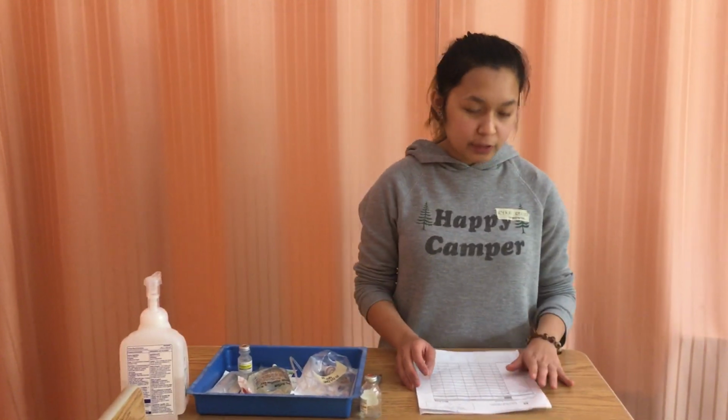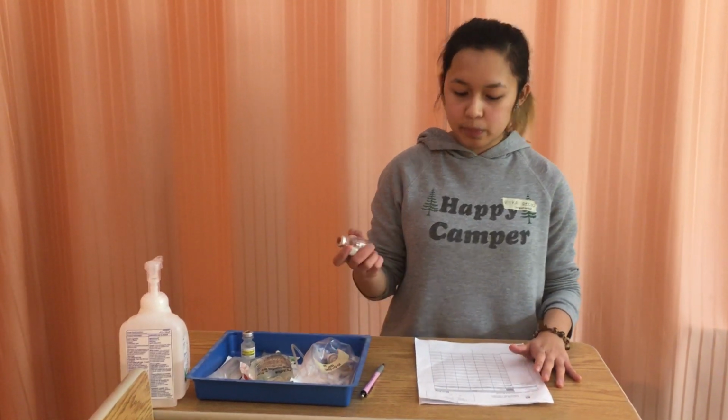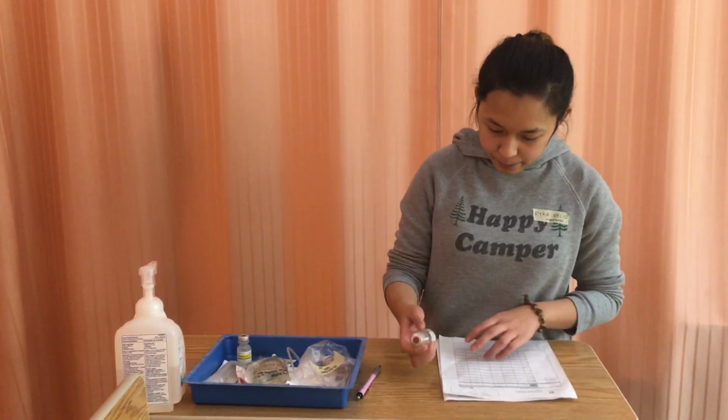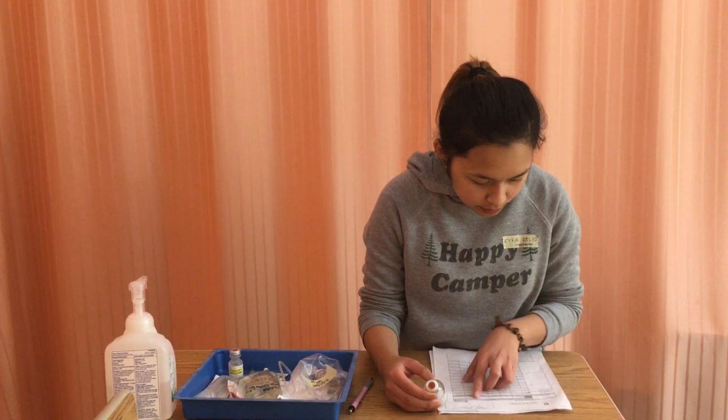So I've already compared my physician's order against my MAR and I've pulled up my medication from the Pyxis room. So now I'm just going to compare my medication against my MAR. So this is Regina Phalange, the patient, and she has no known allergies. The medication is penicillin G sodium, 3.5 million units, IV every 4 hours. The time right now is 1800.